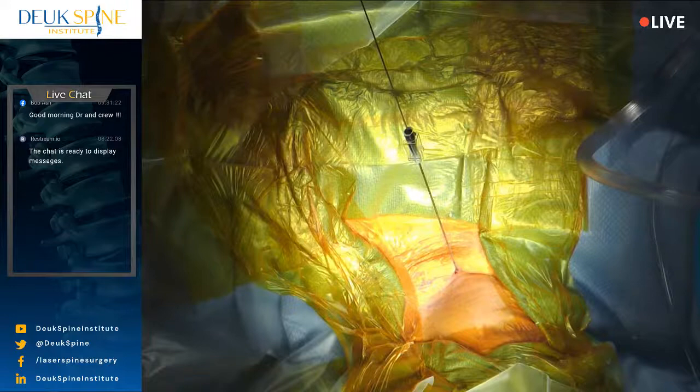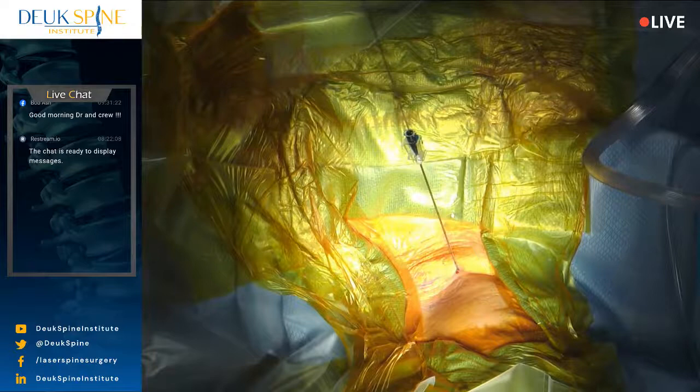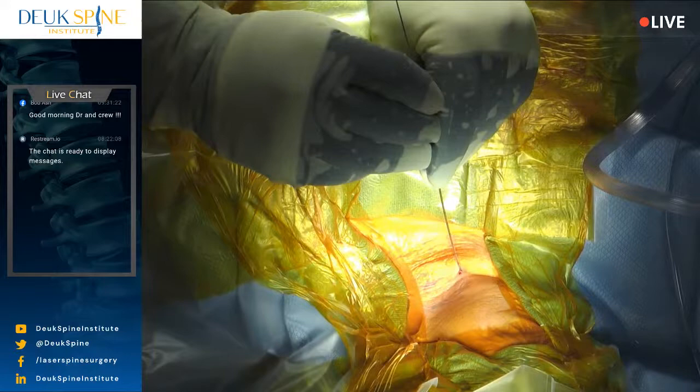Show me a shot. When I look up, it means take a shot. We just put the guide wire in. So her disc is pretty collapsed, and that's fine. That's not what we're here to fix, a collapsed disc. We're here to basically get the pressure off the nerve going down her right arm and to treat her neck pain. So right now I could see the guide wire is sticking out. That's good. Shot.